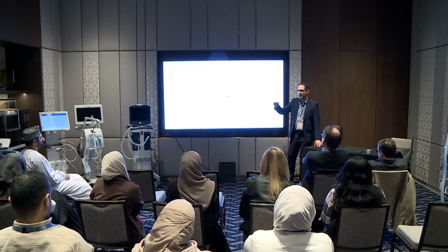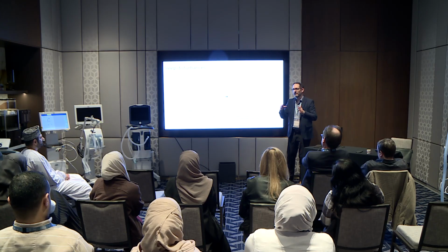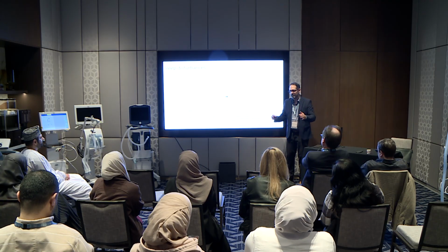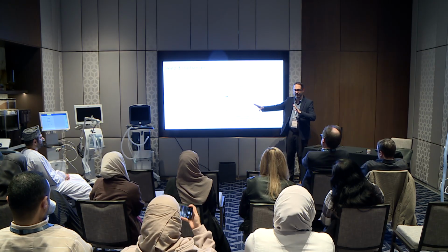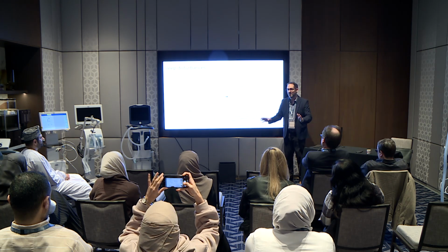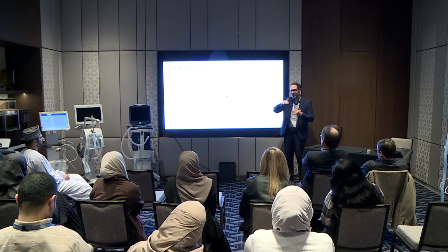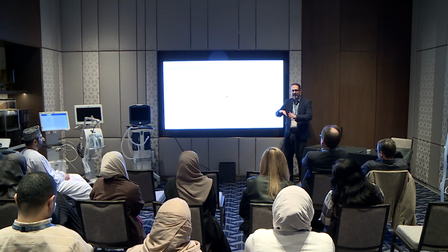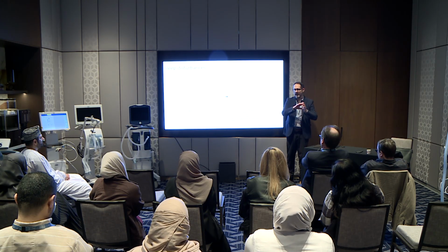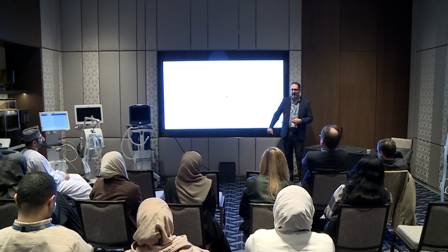PAV and NAVA are proportional modes that cycle off when the patient doesn't want the breath anymore. The best evidence we have so far, and there's another randomized trial that just finished and will hopefully be published this year, is that it's superior for sleep quality. Why? Because you can't over-support the patient. When it cycles off properly, it down-regulates with them. When they go to sleep, it sort of follows their pattern. It doesn't over-hyperventilate them, but pressure support can do that, and so you have these apnea thresholds.